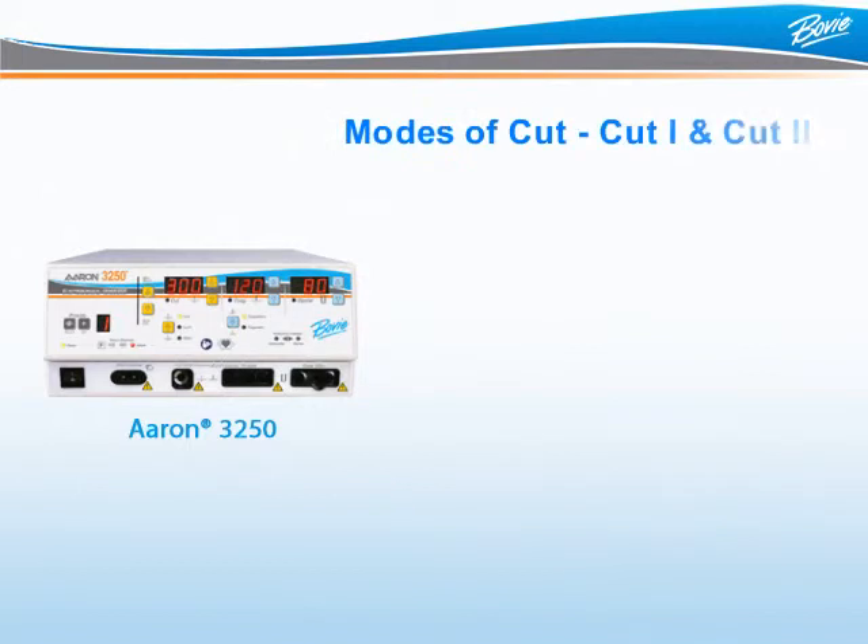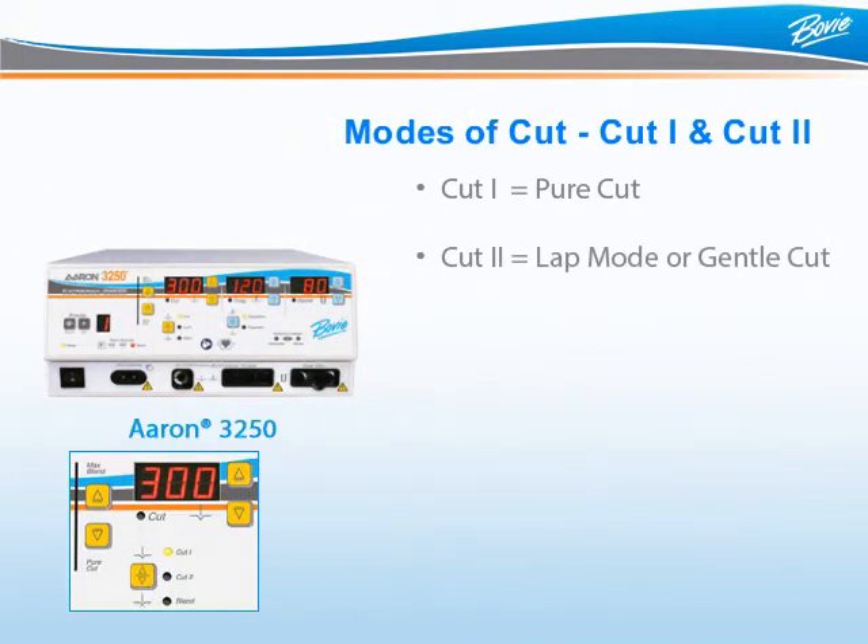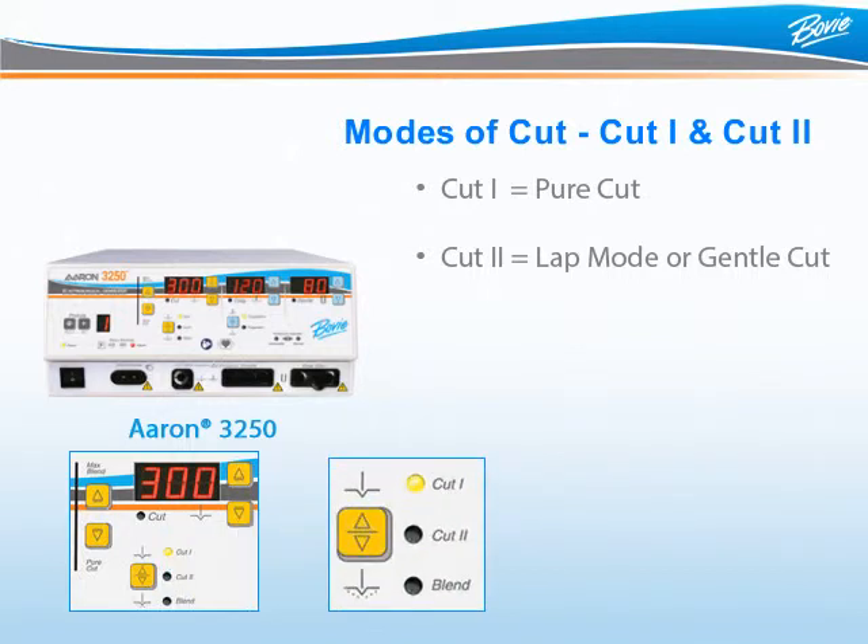The ARIN3250 has three modes of Cut: Cut 1, Cut 2, and Blend. To activate any Cut Mode on the ARIN3250, press the yellow button with two triangles so the proper Cut Mode LED to the right is illuminated.